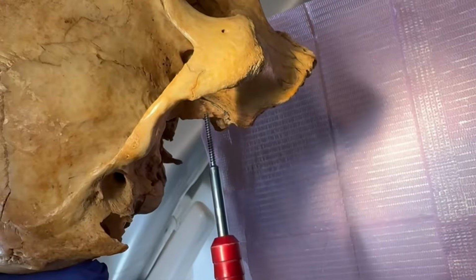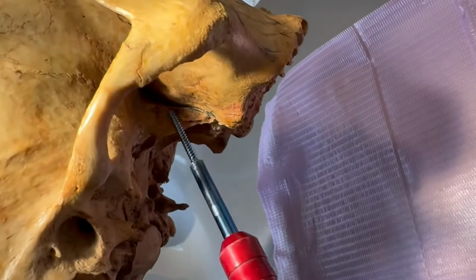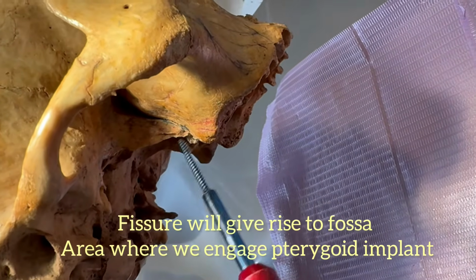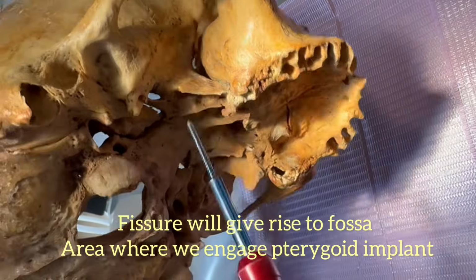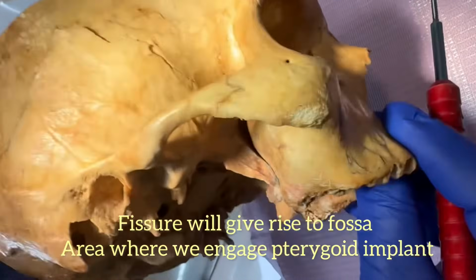So this is the fissure, pterygomaxillary fissure. You can have a look. This is the fissure which gives rise to the fossa. Fossa is the area where you are going to engage your pterygoid implant. That is the area between the lateral pterygoid and the medial pterygoid. This is the area. So I'll tell you the osteotomy.